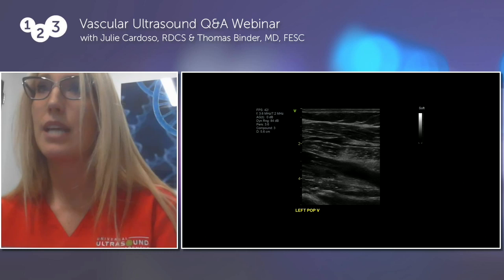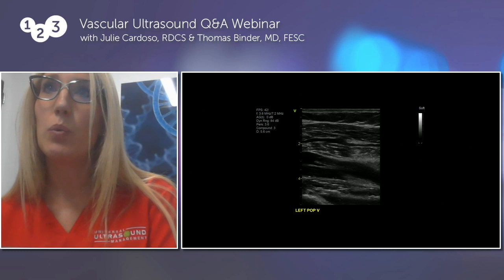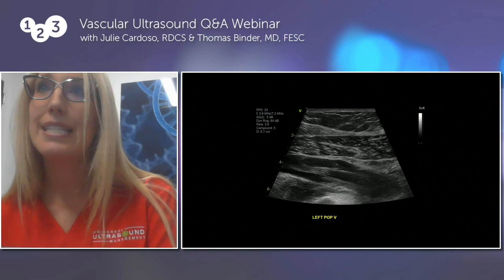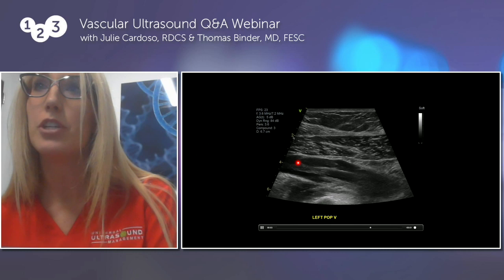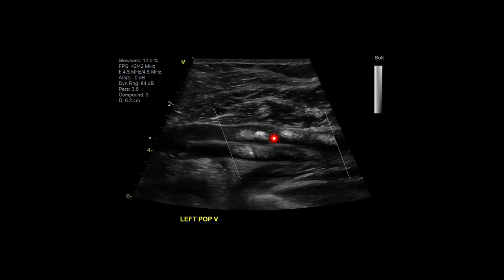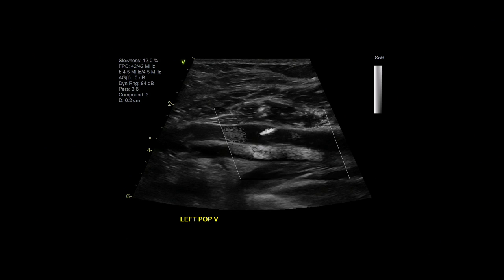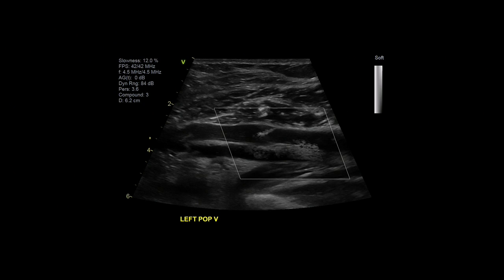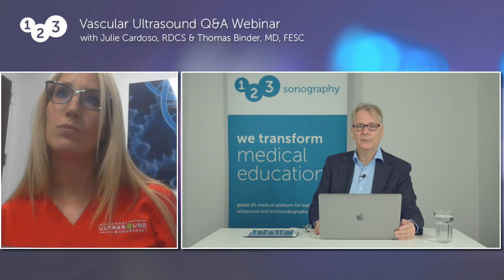Deep vein insufficiency can also be caused from venous hypertension and trauma. Using B-flow imaging, you can see the insufficiency — the backward flow, the bi-directional flow — going towards the heart, and then the deep venous insufficiency caused from the thrombus going through those valves so that the valve is unable to close completely.